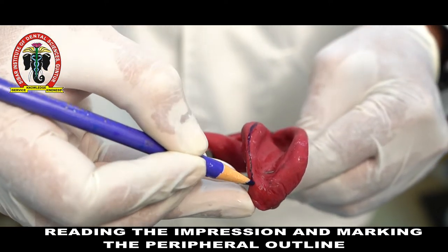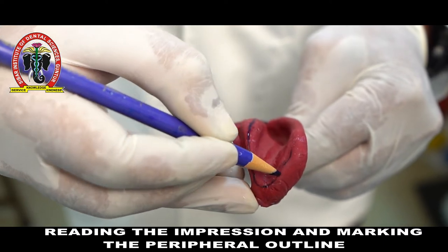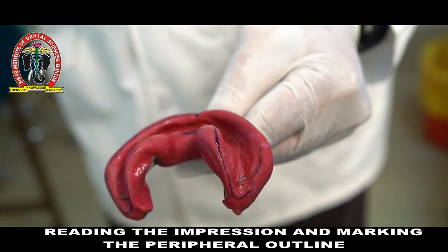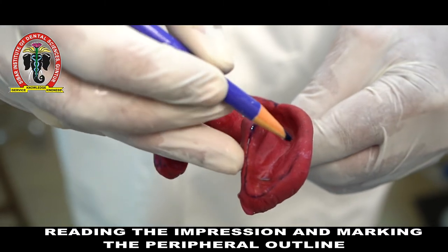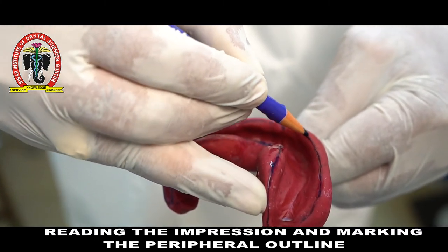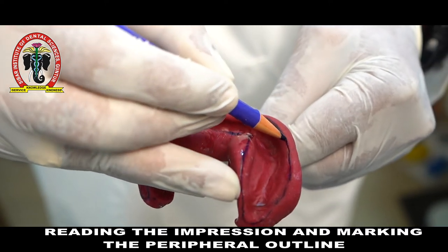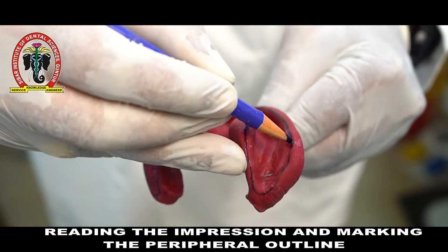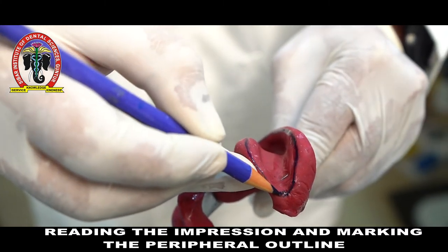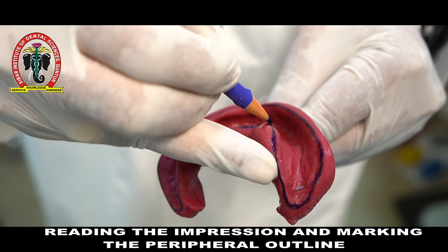This peripheral outline line will guide special tray fabrication. This marking is transferred to the diagnostic model, and the special tray is extended up to this line. The special tray will then be checked in the patient's mouth and made 2 mm short from the functional depth and width of the vestibular areas.